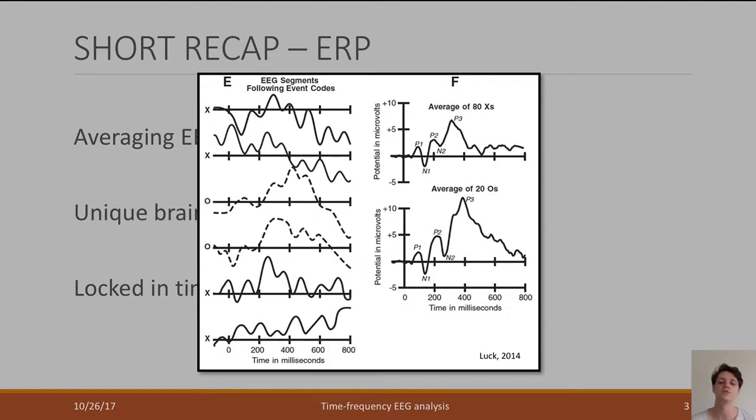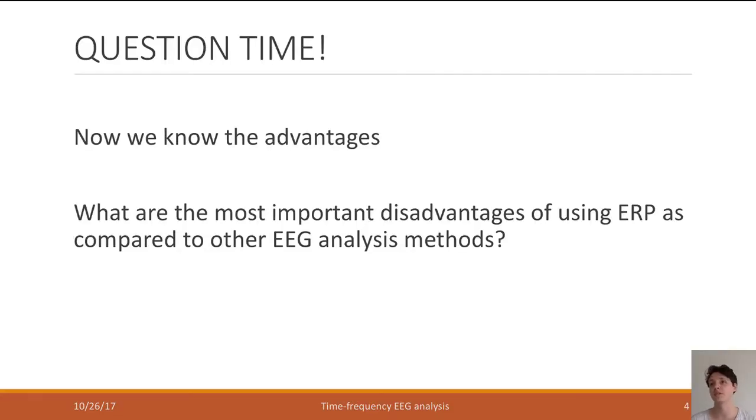On the left side, you see the different trials, and all the trials are quite noisy. Then when you average them together, they all get the same characteristics. For example, you see a positive peak, a negative peak, and then a positive peak again, a negative peak, and then a positive peak again. These characteristics, and especially whether and when in time they happen, are usually correlated to behavior. While ERP is therefore very resilient against noise, and you can get a very clear stimulus and response loop into your data, there are a couple of negatives about ERP.